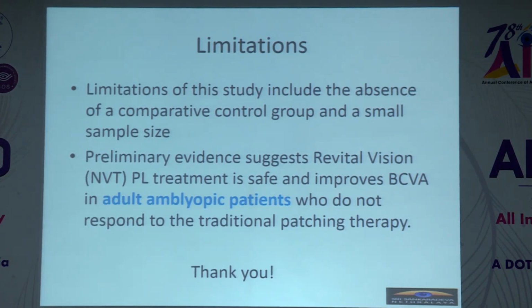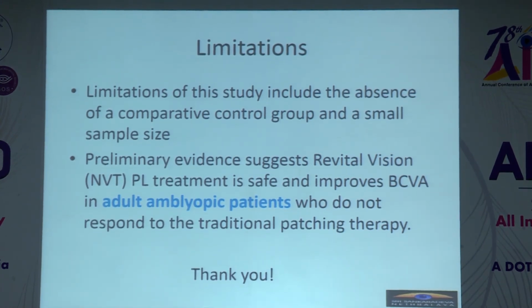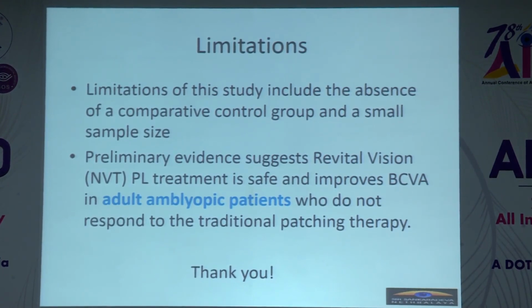Preliminary evidence suggests Revital Vision or Neurovision therapy, a perceptual learning treatment technology, is safe and improves best-corrected visual acuity in adult amblyopic patients.